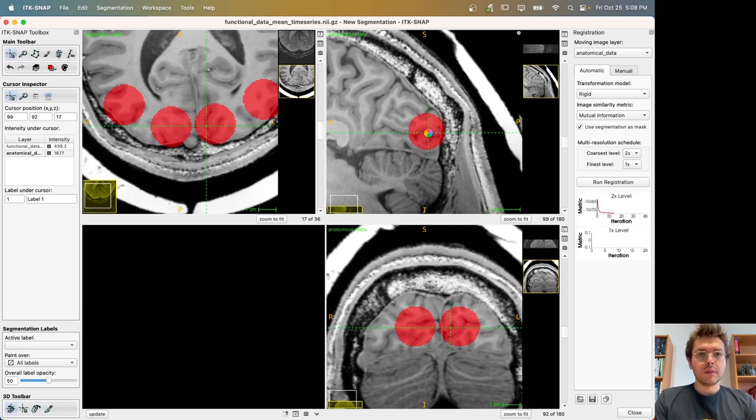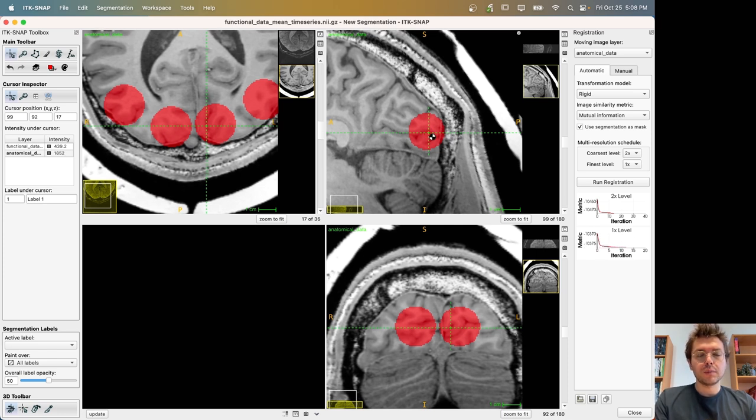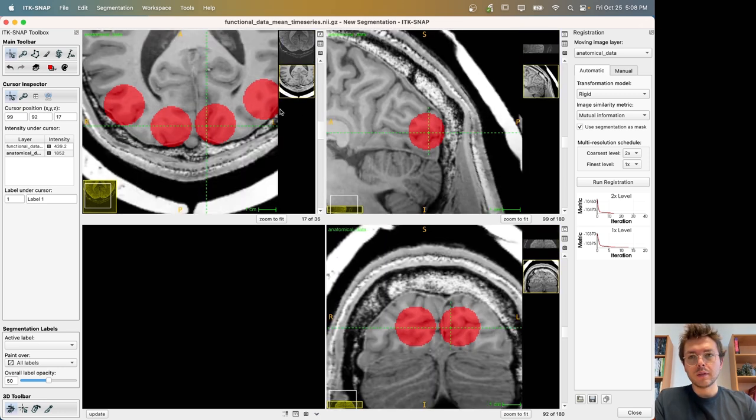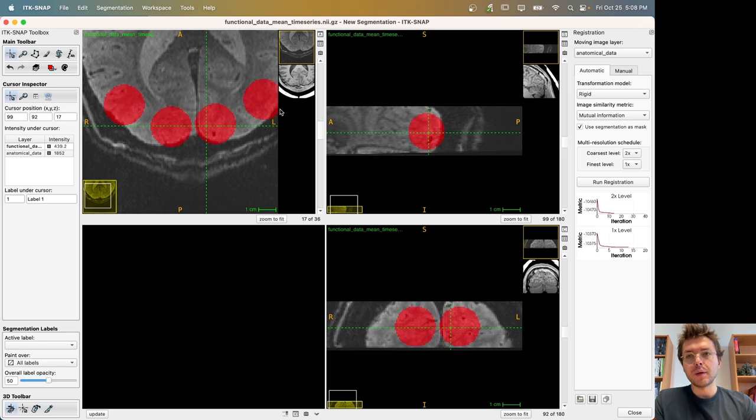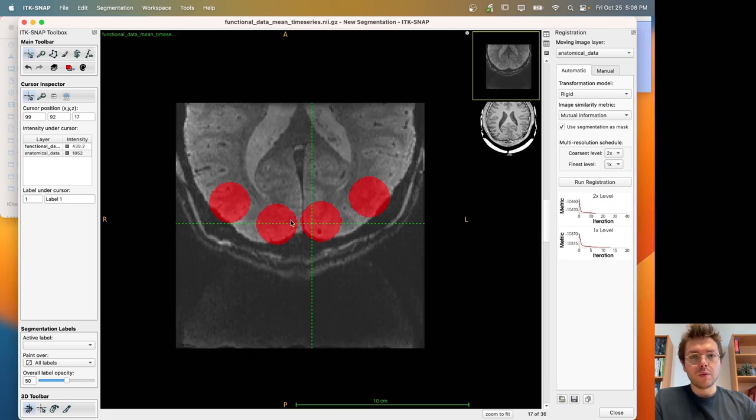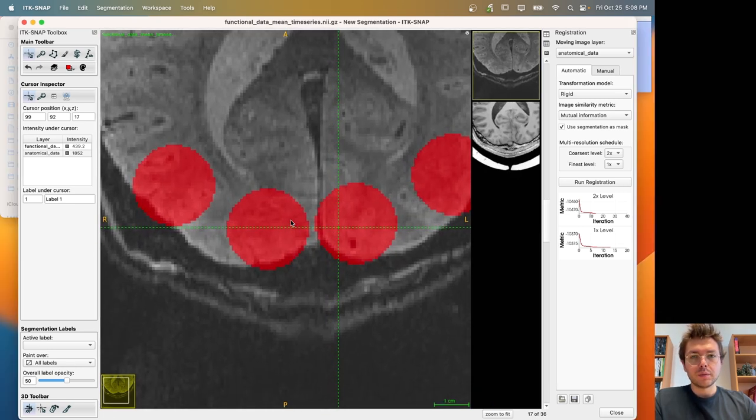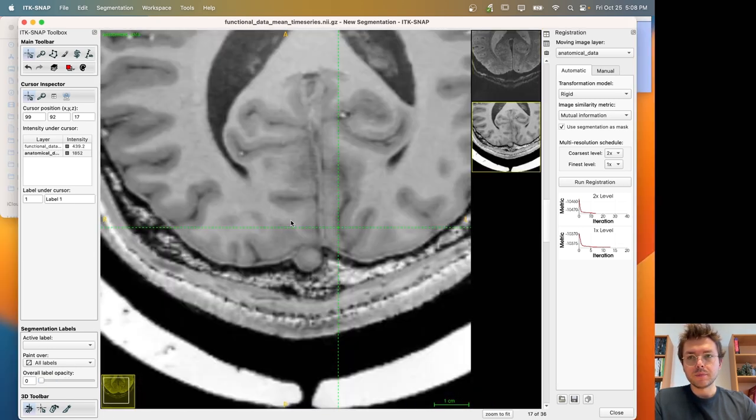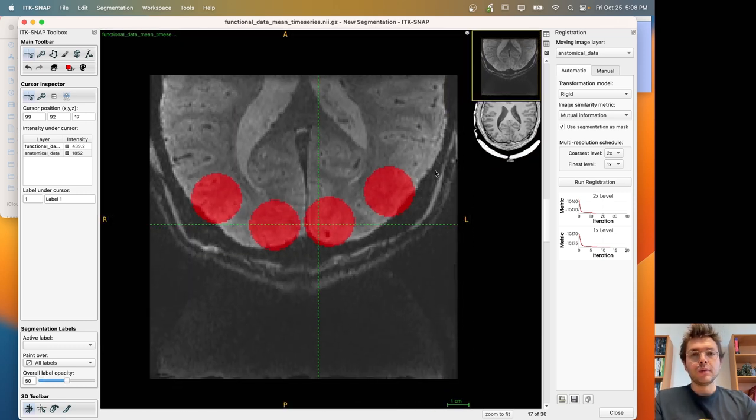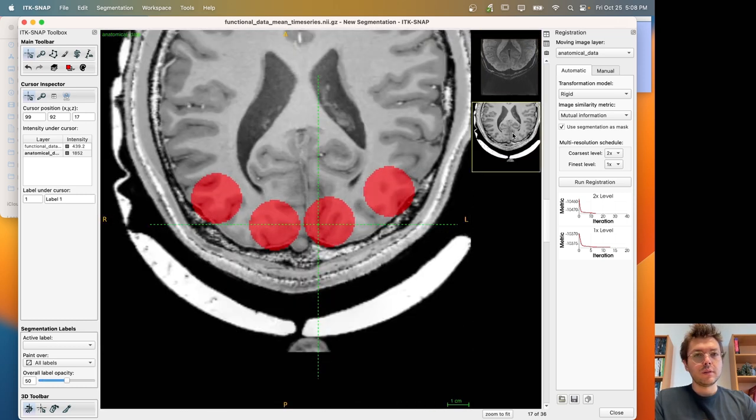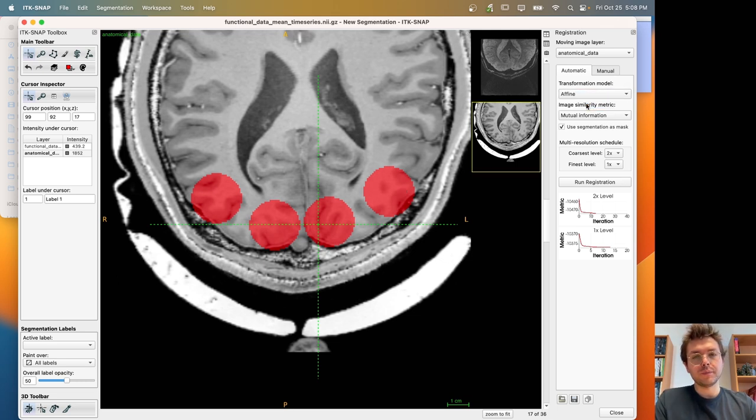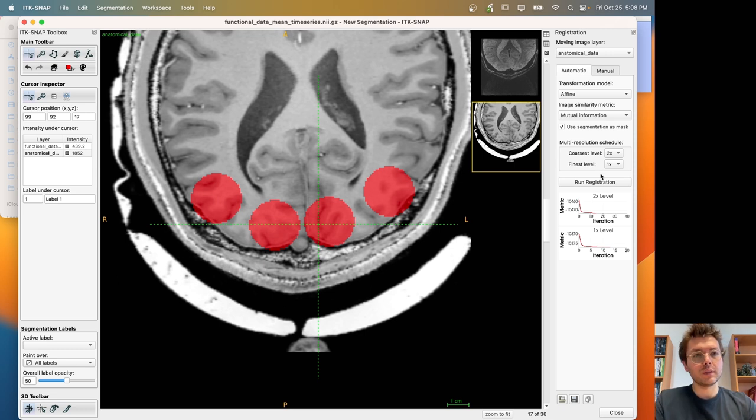You can see that the brain has moved a little bit. The registration algorithm is already working to minimize the cost metric. And now, it is finished. We can again use the brackets to switch back and forth. And maybe sometimes use S in your keyboard to turn on and off your segmentation mask. And maybe have a look at the registration, whether you are happy or not. Just to demonstrate this method of optimizing your registration based on a region of interest, I'm going to also use the affine method now. So that there will be a bit of shear in the registration as well. And run again.